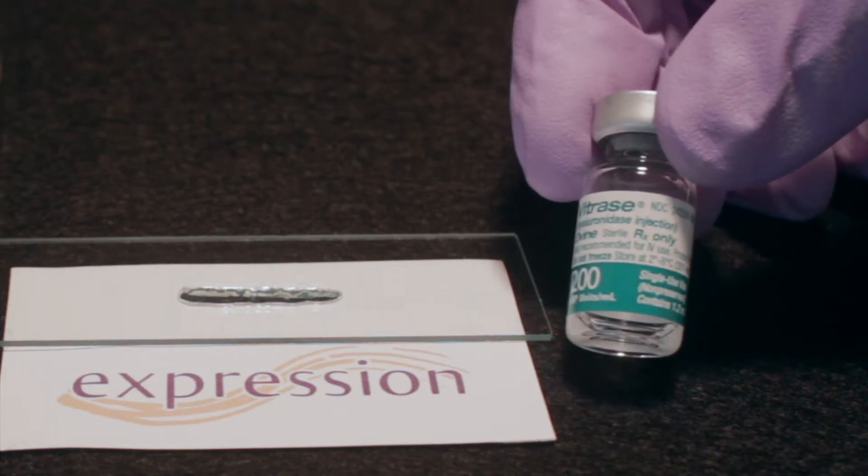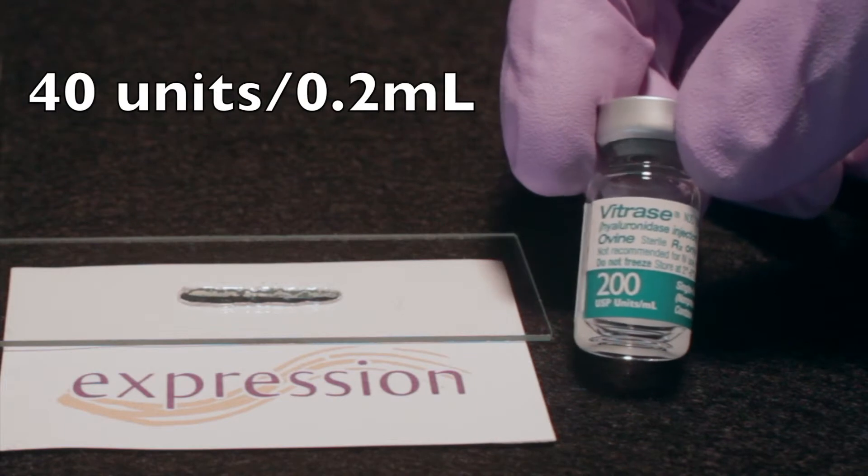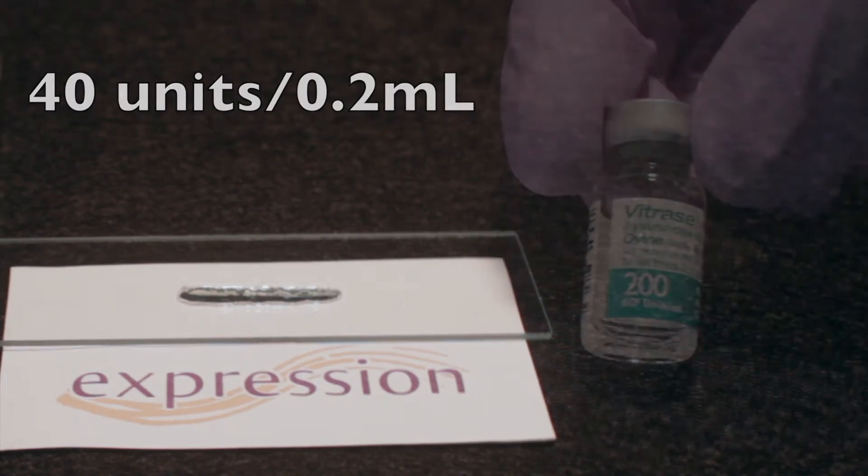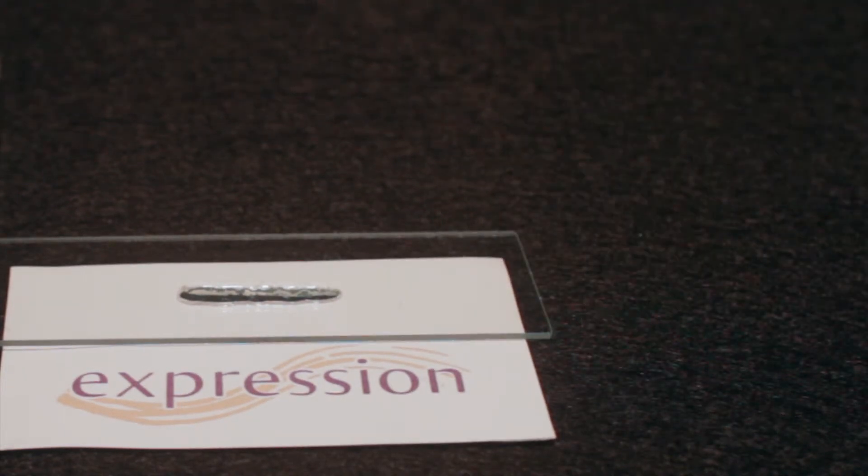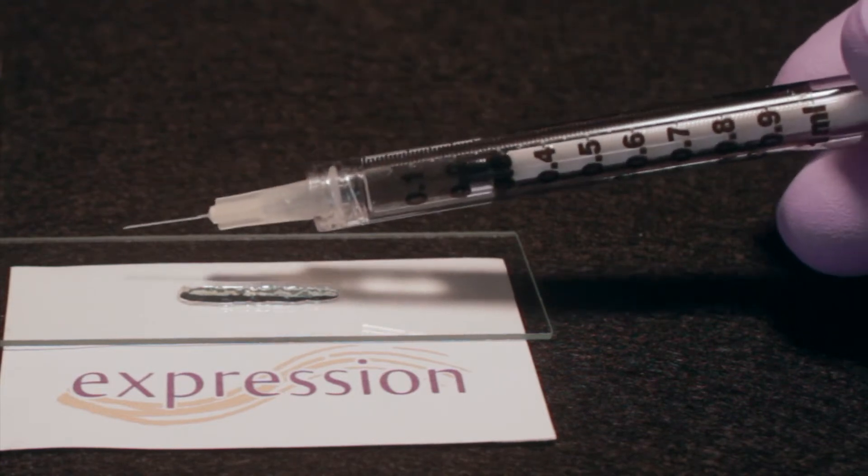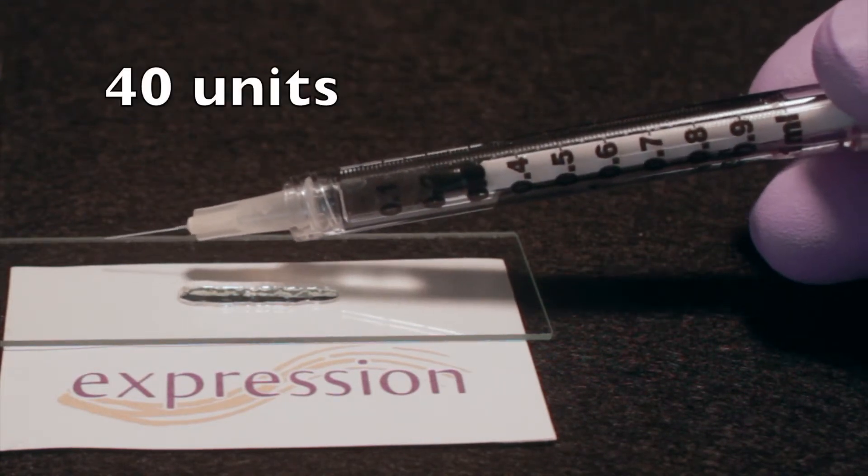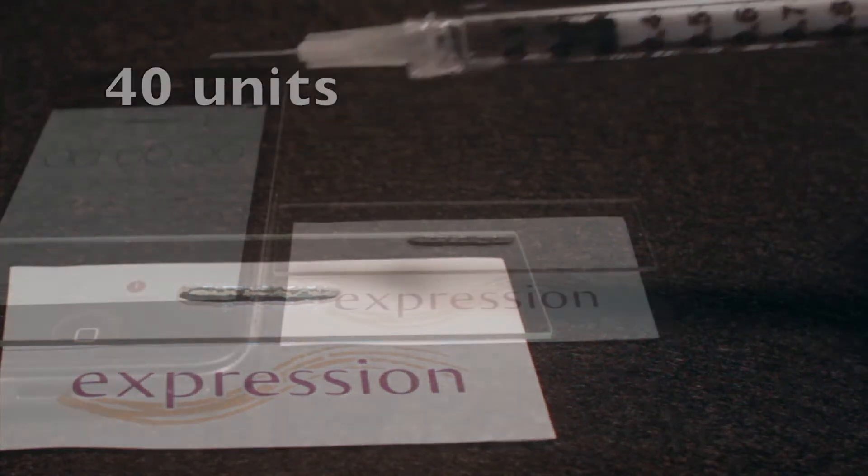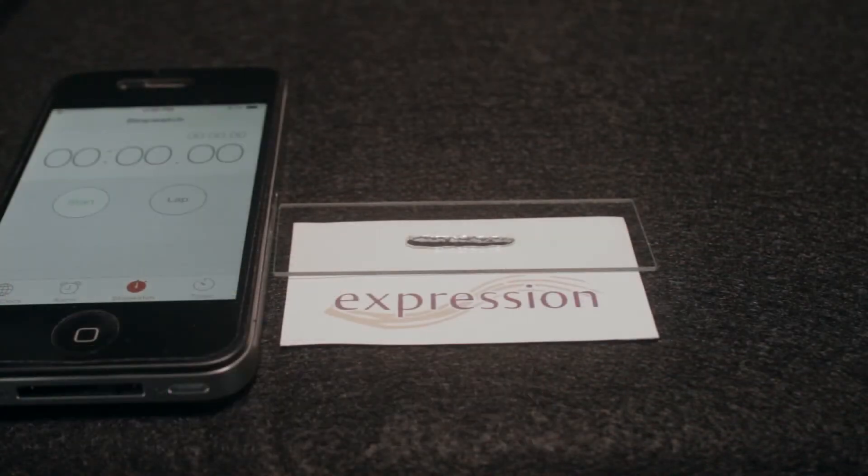Therefore, 40 units equals 2 tenths, or 0.2 ml. Now, I've prepared a syringe with the desired amount of hyaluronidase, which in this case is 40 units, drawn to the 0.2 cc mark.